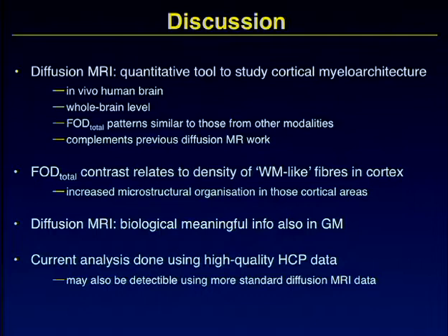Any questions? Because obviously, if we're able to do N = 1, the interesting thing would be to start looking at even cortical malformations, cortical dysplasias, and things like that. But even if we are not able to do the full myeloarchitecture, it might give us an idea that the things we're starting to see with this multi-tissue CSD in those gray matter structures, we can trust it, and we can start tracking inside the cortex and see what the connections and patterns in the cortex are. So although we may not be able to do a whole brain myeloarchitecture, it may tell us that we can trust looking at a focal area in a lot of detail. But that's something we have to try.